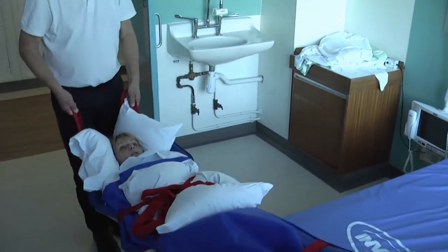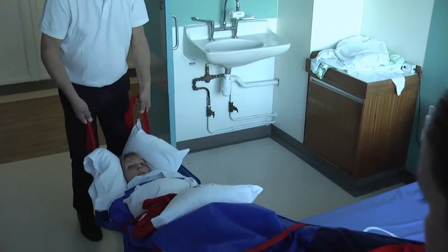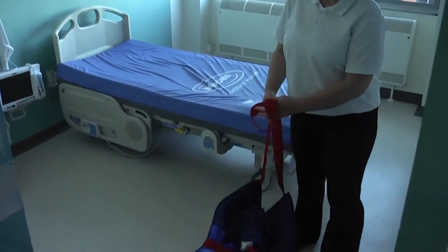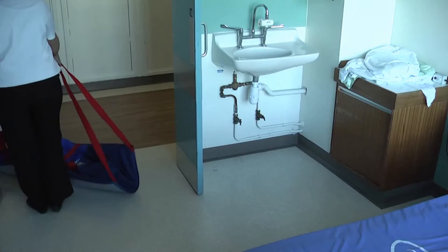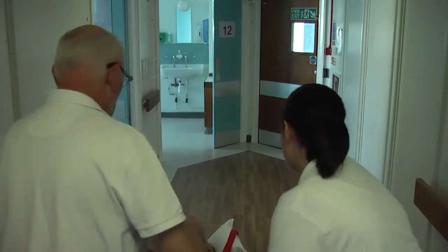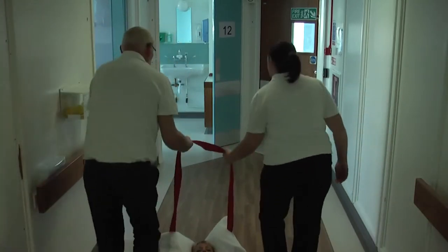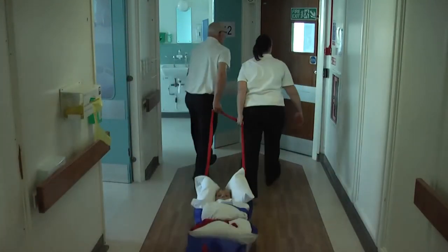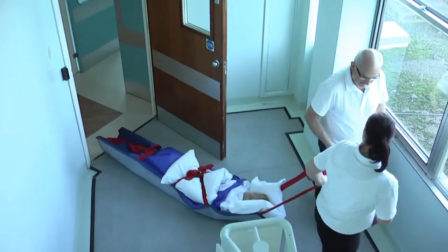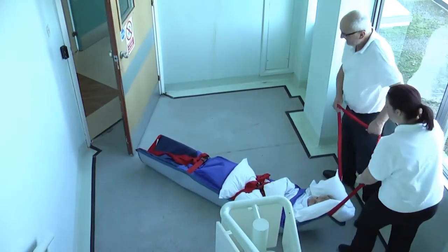With a person at each end of the ski slide pad, take hold of the end straps and move the user into a position where they're lying at approximately 90 degrees across the bed. The person at the head end keeps the strap short and starts to move backwards, allowing the ski slide pad to touch the floor. The foot end operator allows the straps to move through their hands, controlling the descent of the ski slide pad onto the floor. Once on the floor, both operators should pull from the same end. If doors are to be negotiated, the ski slide pad should be pulled from the head end to avoid doors closing on the user's head. However, it is vital that the user approaches the stairs feet first.